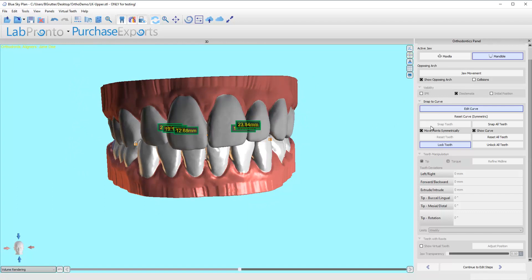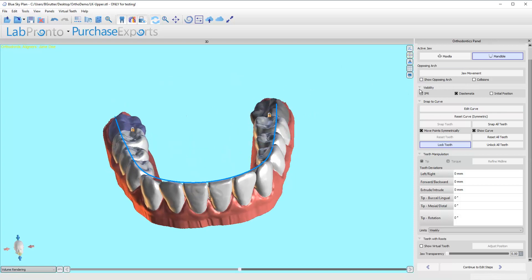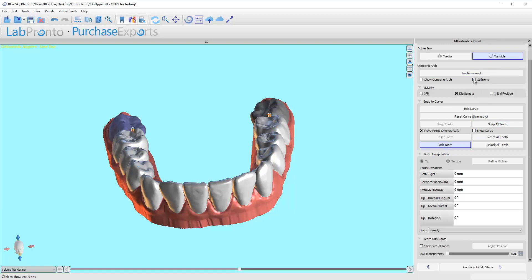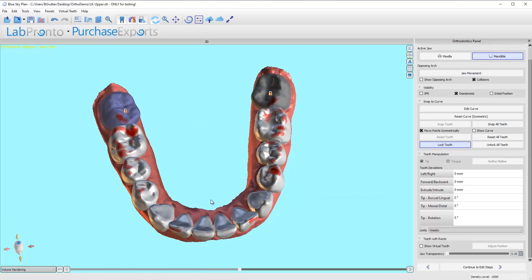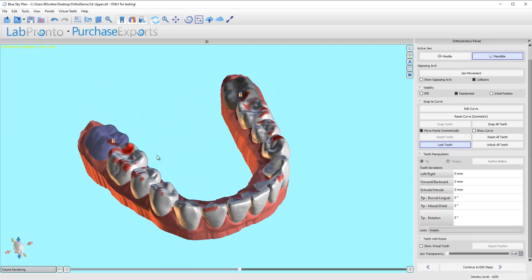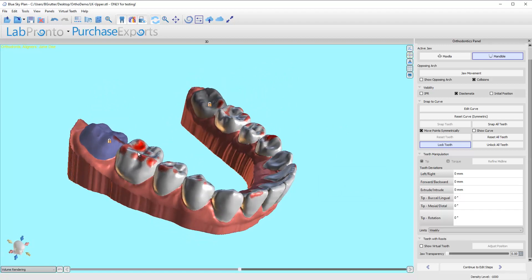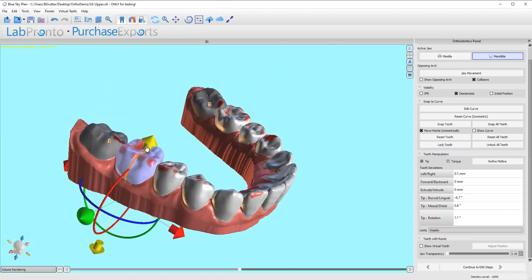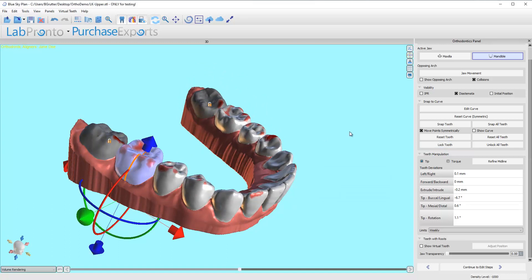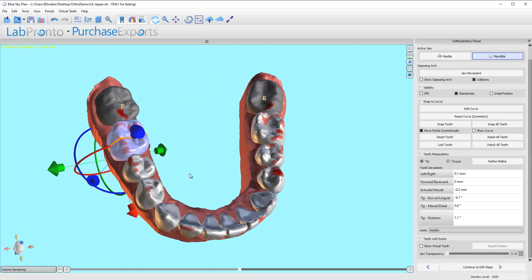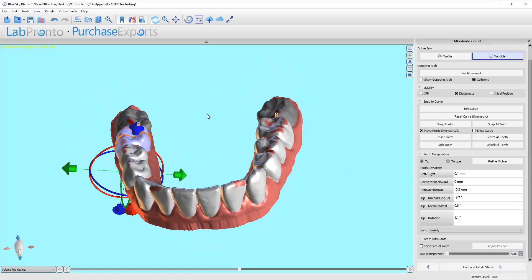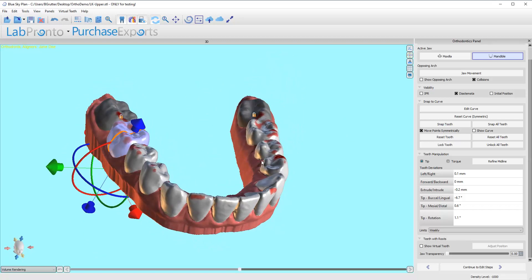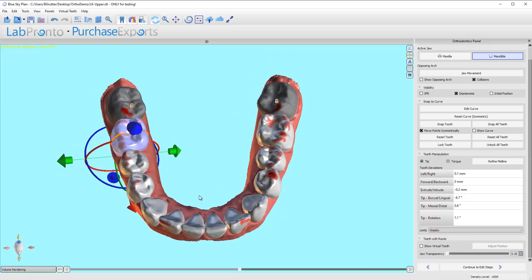I can also go in—and I'm not going to spend much time on it in this video—but I can turn off the curve, just go ahead and hide it completely, click on show collisions, and that'll actually show me sort of a heat map of occlusal contacts. If that's the case, I can start tipping teeth in more or less, I can also intrude or extrude. I can say okay, this tooth needs to come down a little bit. Probably going to have them use a munchie and really chew on that tooth to try to really make sure it intrudes. So there's some other mechanics to help with that.